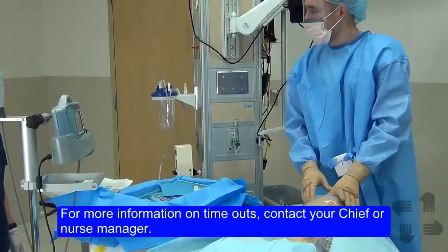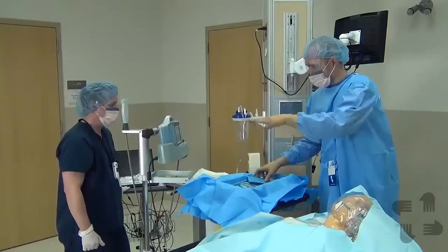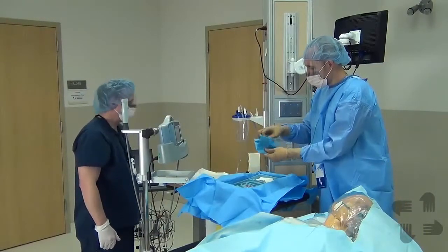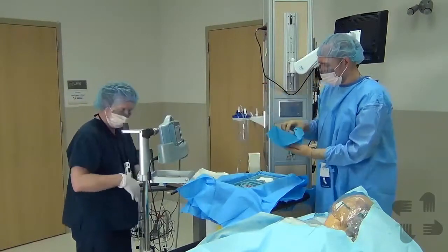So let's do a timeout. All right, I'll grab the consent form. Okay, let's sterilize the ultrasound machine. So just be careful here because we got sterile field here and sterile field here. I'll be as careful as I can. And while I'm getting this unfolded, would you mind putting some non-sterile ultrasound gel on top of that probe?